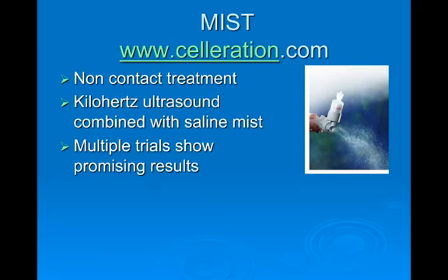All right, but that brings up another fairly recent use of ultrasound. You can go to this website, celleration.com, and I think they've got some videos there that you can look at too. It's called mist therapy, and this is very low level ultrasound, kilohertz instead of megahertz, combined with a saline mist.